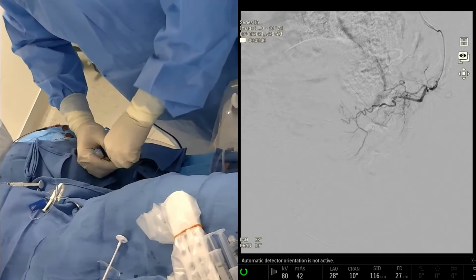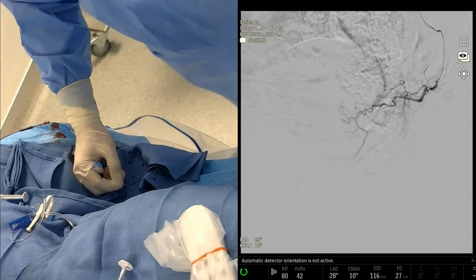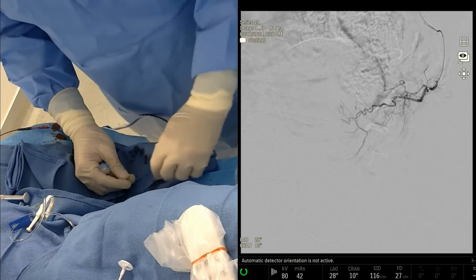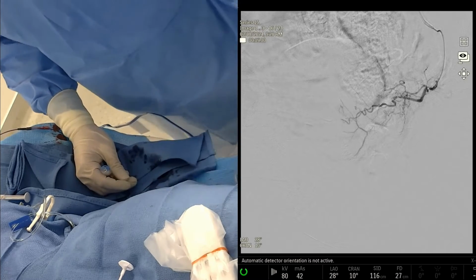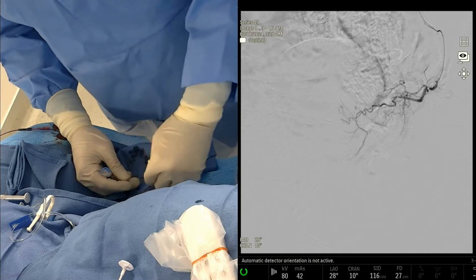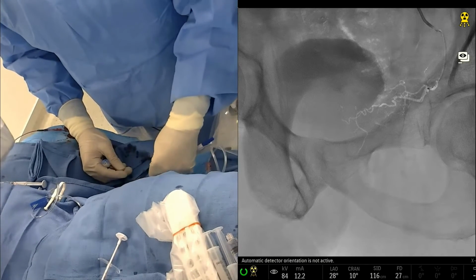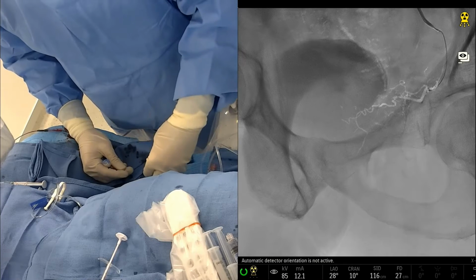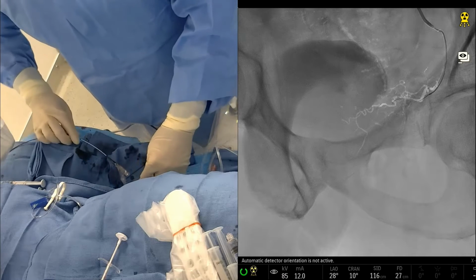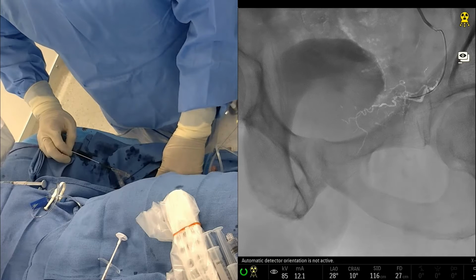We often get distracted by the main prostate artery and forget about collaterals. There are often multiple pedicles that feed the blood supply to the prostate, in particular the pudendal below and the superior vesical above. In those scenarios, the cone beam CT with embolization guidance can actually show you all the feeders at once. But there are angiographic signs that allow you to do that without potentially needing to do that. And then the last reason we do cone beam CT is to look at the coverage of the gland after embolization, which we may actually do today to show what that looks like for everybody as a demonstration.